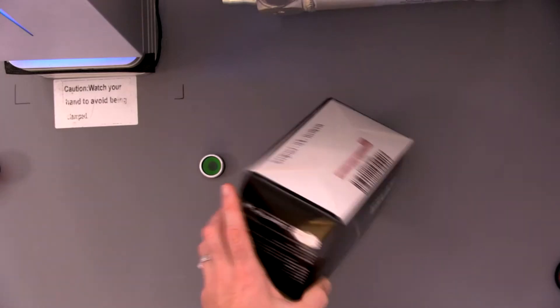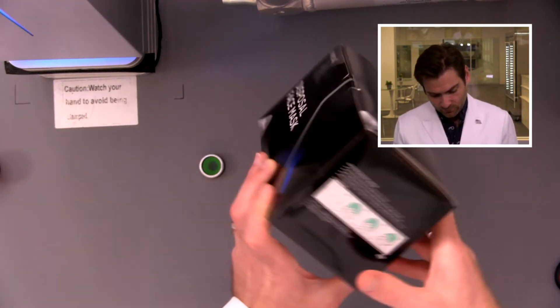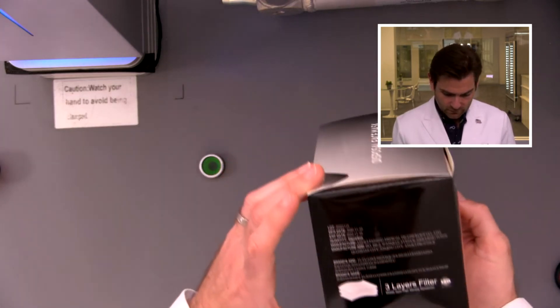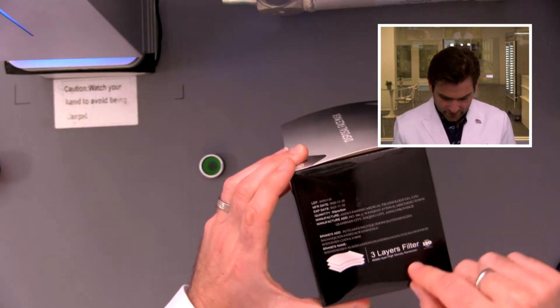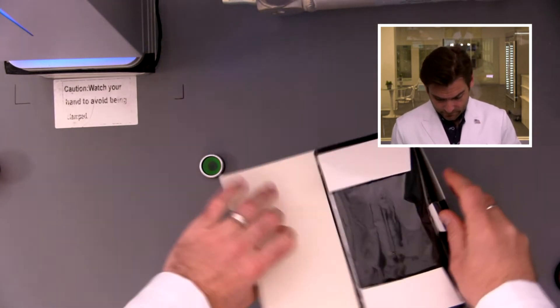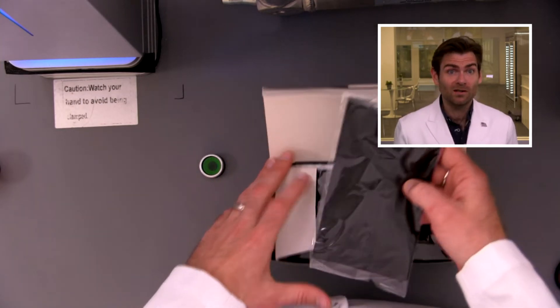Let's look at the box — pretty basic. It says disposable face mask, made in China. Not making any claims, so that's good. Oh wow, they're individually packaged — that's so cool!